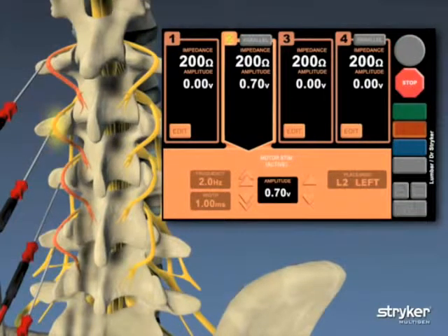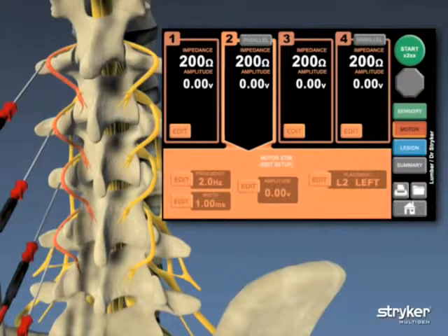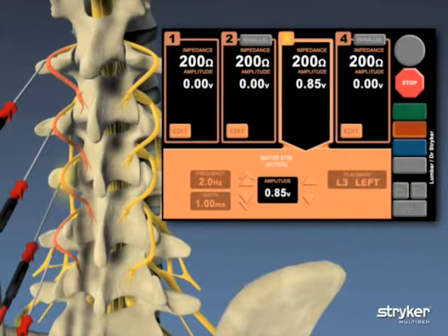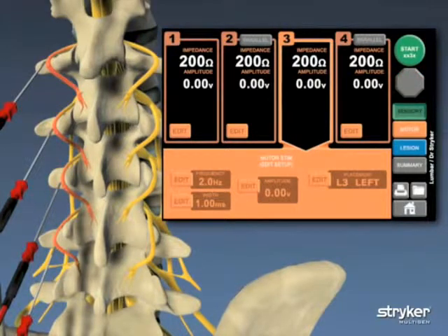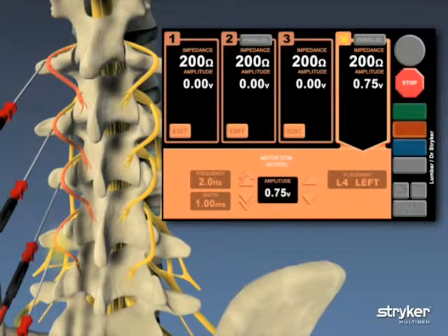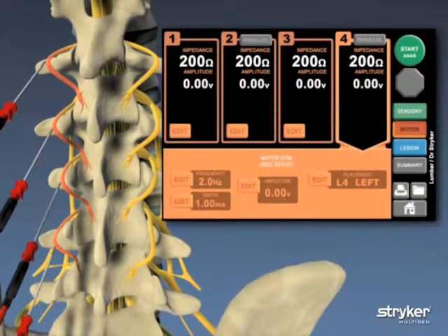The motor stimulation test will help confirm correct needle placement in all four locations, while helping to ensure that each needle is not on a motor nerve. The lesions themselves will be run simultaneously; the sensory and motor tests are done individually at each location to help ensure accurate results.